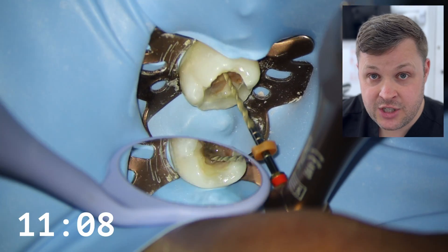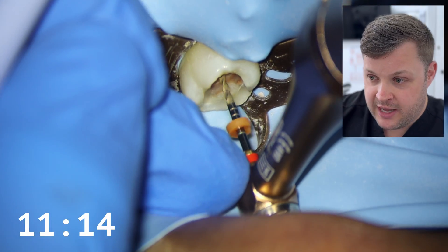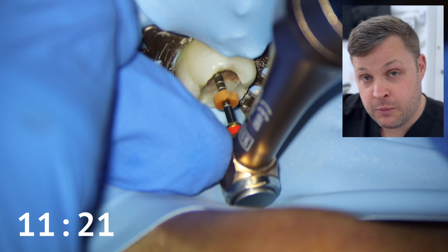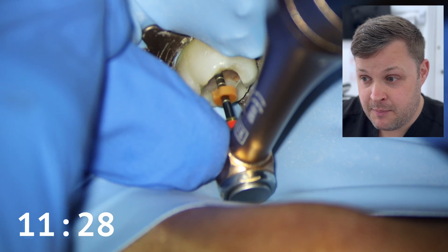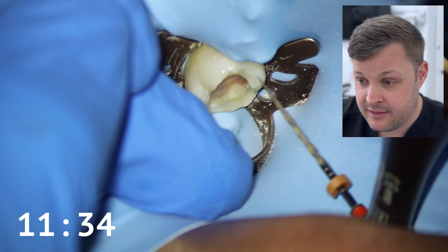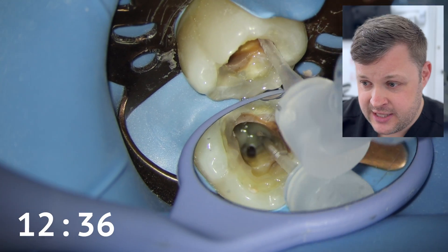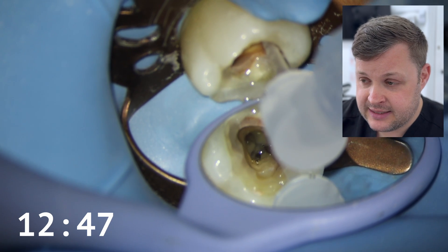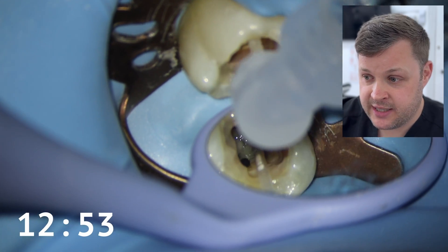I don't want to push the size 25 master apical file to length because I don't want to fracture the file or ledge the canal. As you'll know from my other videos, if you open up the coronal to mid-third of the canal, a lot of the time if you're struggling to get to the apex, opening up the canal can help you reach all the way to zero. I know how far I got with the glide path, so I'm using the size 25 a little bit further back than that — lots and lots of irrigant. Here is our first indication that the two canals are joined: I'm aspirating the irrigant in the mesiolingual canal and the MB canal is also aspirating, so we know they join.